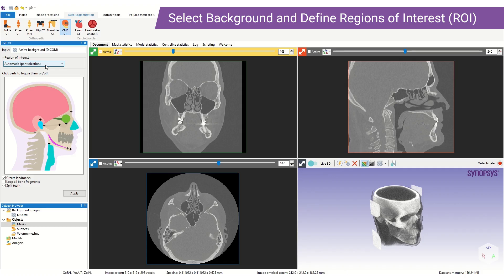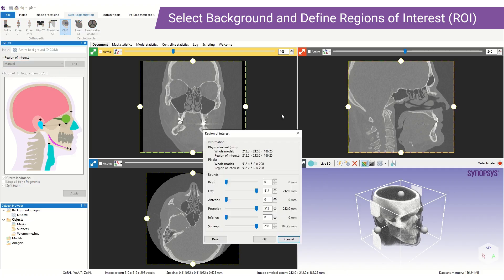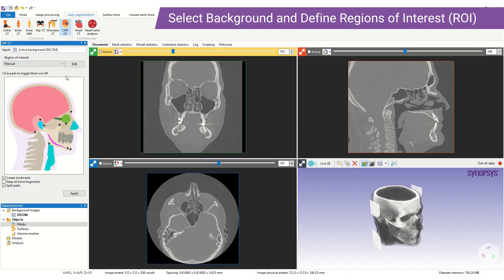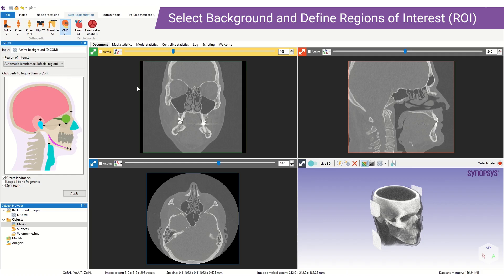Additionally we can edit the ROI manually in the 2D and 3D views. In addition to being an option for specifying the ROI, the part selector diagram is used for defining the parts output by the tool. We simply click on an anatomy to toggle the parts off and on. By default all the structures are on apart from the skin.